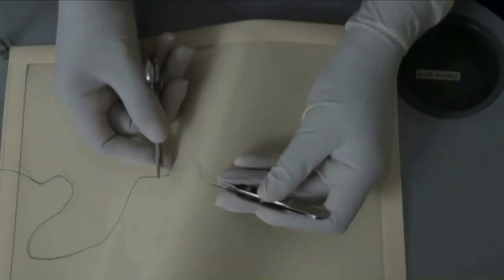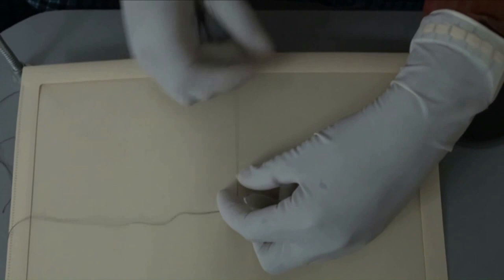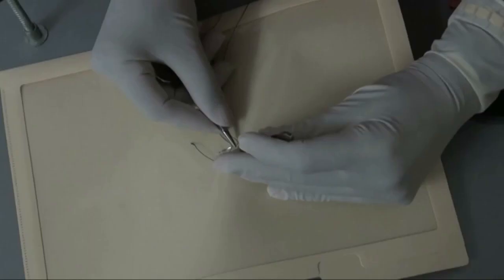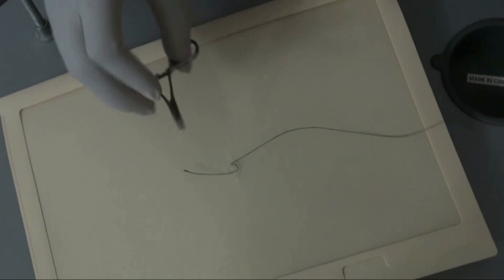The needle holder fits into the palm. Ring finger is in the ring of the needle holder. Hand is taking support on a stable surface in the surgical field. The point of needle penetration, force, direction, and curve of the needle path are precisely controlled. At all points of time, some part of the hand is supported on a stable surface. Index finger protects the part while the needle holder is being released. It adds extra safety to the tissues being sutured.